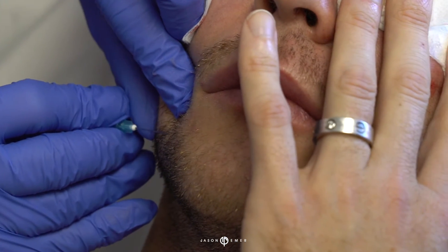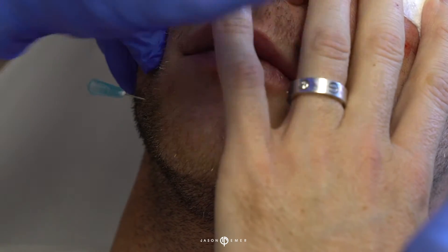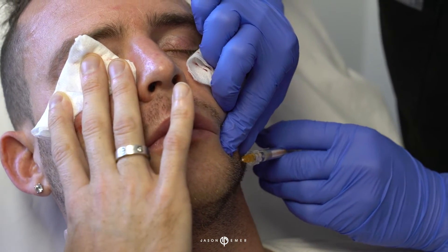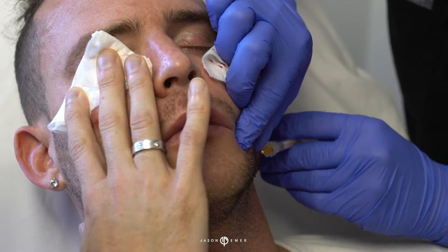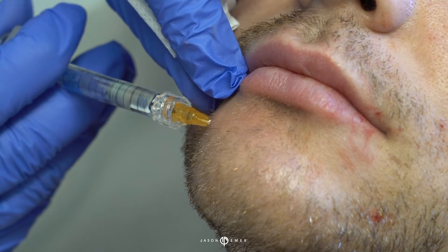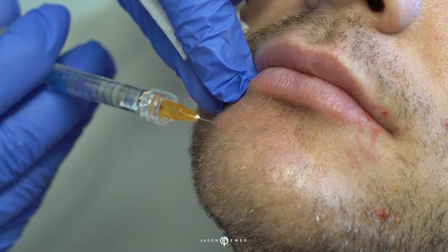He has just a slight bit at the edge of the chin — I have like a teeny dab on each side, just putting a little bit right into the edge of the chin. It'll support his lower lip, and especially for men's lips, you really want to help this crease in the center — it gives him a little more masculine appearance if that crease is filled in.